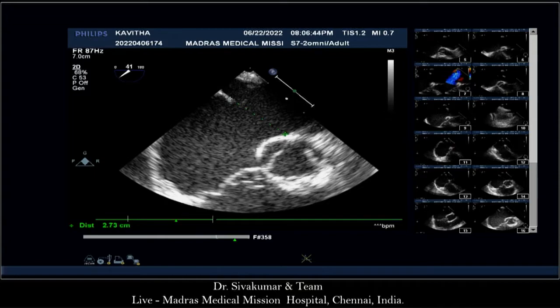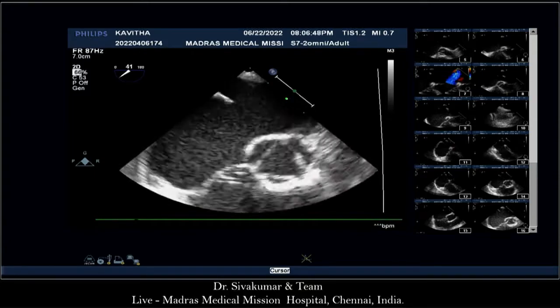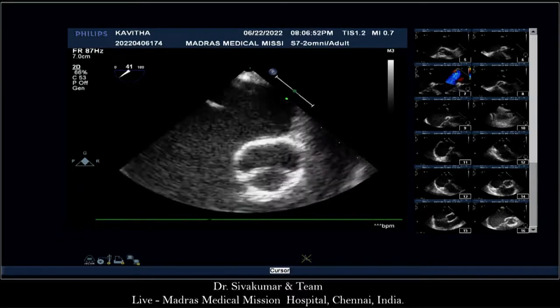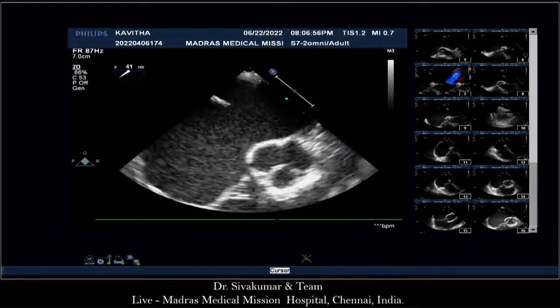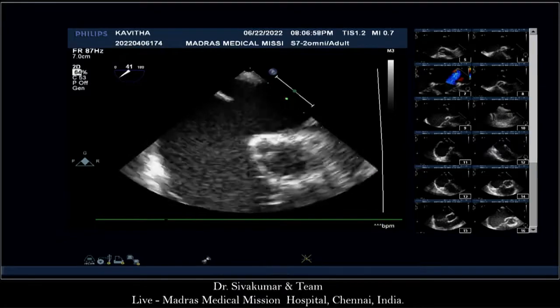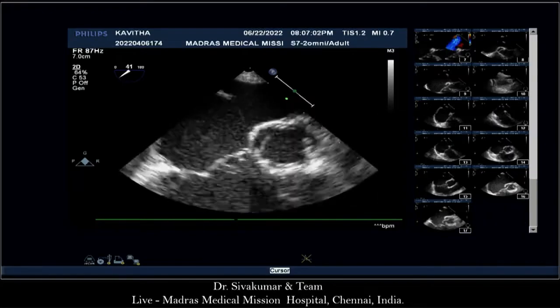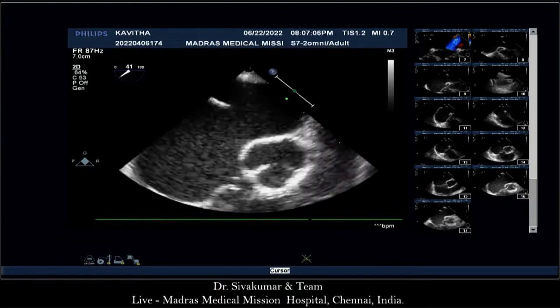No. Stay in the middle of the cusp. No, it is not. Stay there in the middle of the non-coronary. Zahid, the ASD is not there. It is malaligned. Srija, pull it out. You see that it's going superiorly. You see the septum very clearly. They were right in the middle around 10 o'clock on the aorta. Srija, slightly pull out and show that it is going more towards the left atrium.